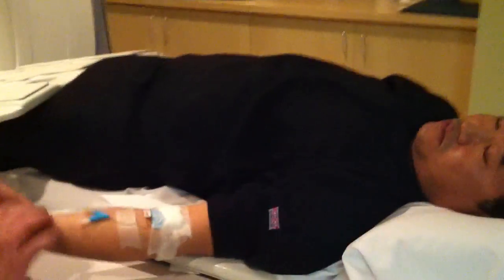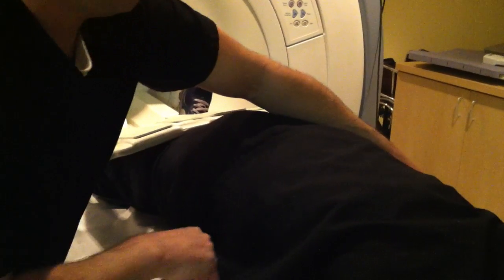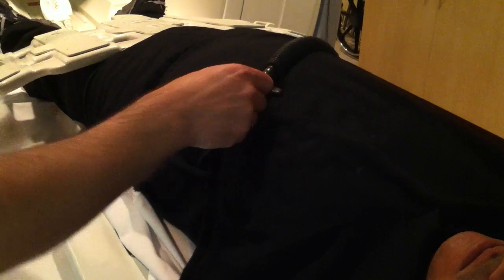We're going to take our patient and have him put his arms up. We want to use the respiratory bellows. We're going to fish this underneath the patient and the bellows lay across. We tell the patient to take a deep breath and you notice if he's a stomach breather or a chest breather. If he's a stomach breather, you wrap it around his stomach. If he's a chest breather, you wrap it around his chest. If you're not sure, you can do it diagonally.